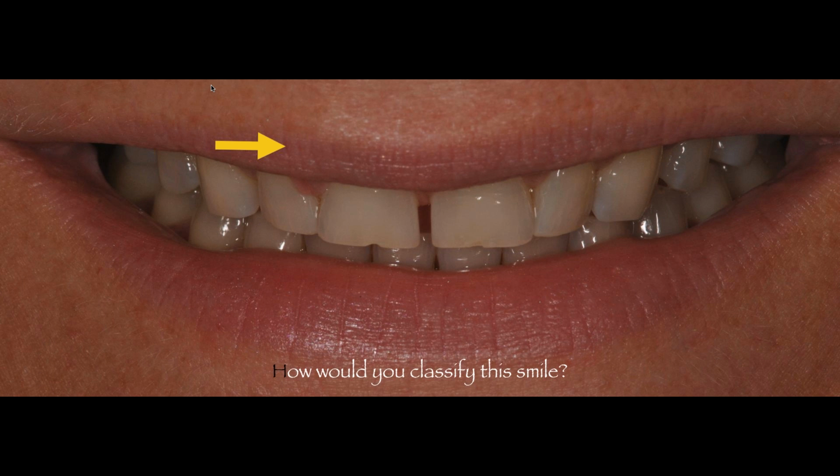So we look at this photo, and we say, okay, what did this patient need? What do we need to do for this patient? So I'm going to analyze the smile of this patient. And the first question I'm going to ask myself is, how can I classify this smile? Does the patient have a low smile line? Is it a medium smile line? Is it a high smile line? I mean, how much teeth display does this patient have? So this type of information I can achieve from this photo.